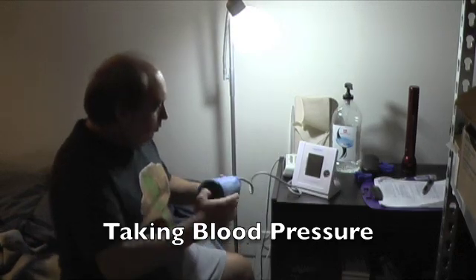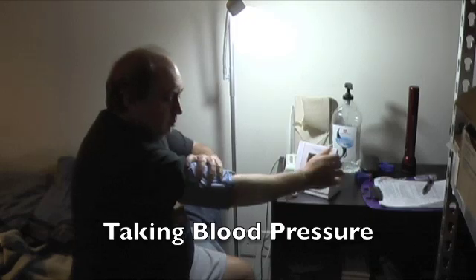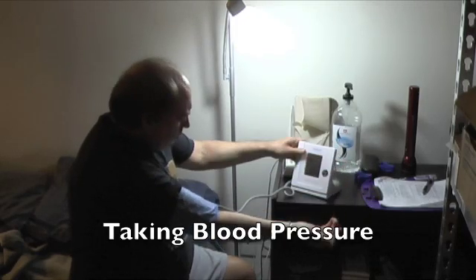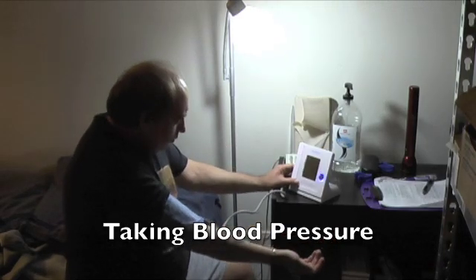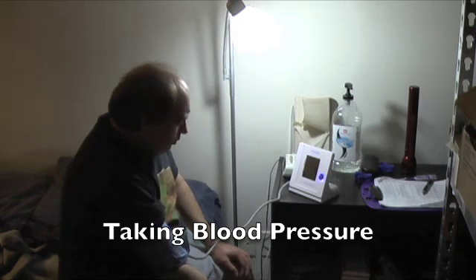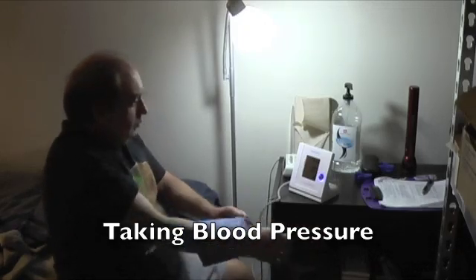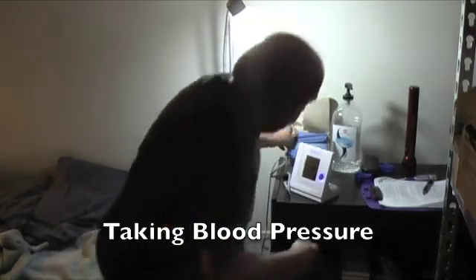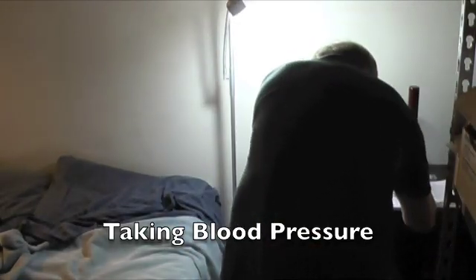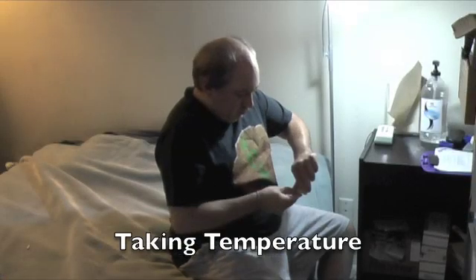The first step when doing peritoneal dialysis is usually taking your blood pressure. Depending on whether your blood pressure is in the normal range, high, or low, it will help determine what strength of peritoneal dialysis solution you will need to use, in conjunction with your weight — whether it's above normal and you have excess fluid or any type of edema.